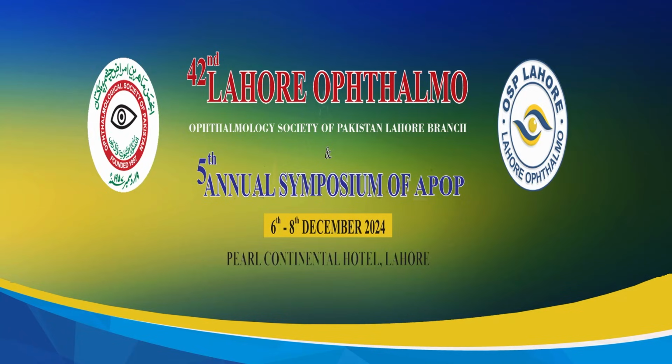Actually, the term peripheral vitreous shave, different people think differently about that. But as the chairs have pointed out, it is better to be safe. You can't leave any vitreous over there, but not as strong a removal of the vitreous as you would do for a peripheral tear in a rhegmatogenous detachment patient. Especially, you have to preserve the lens as well.